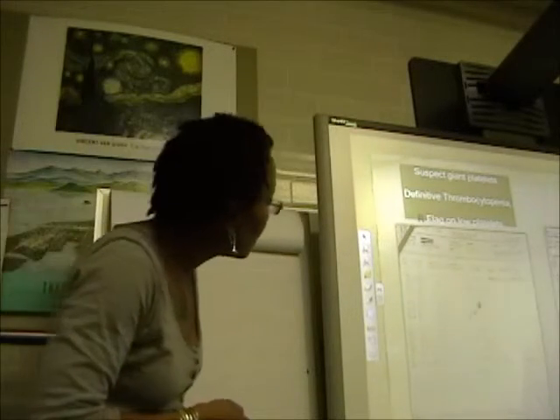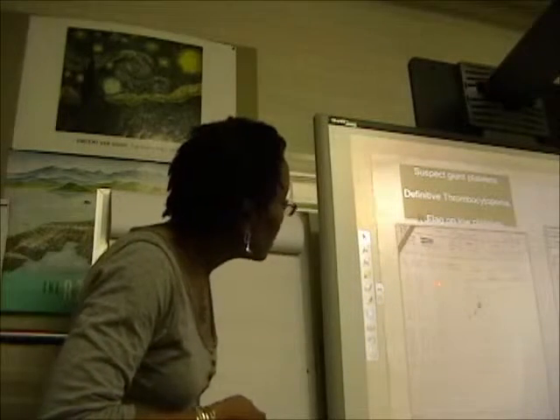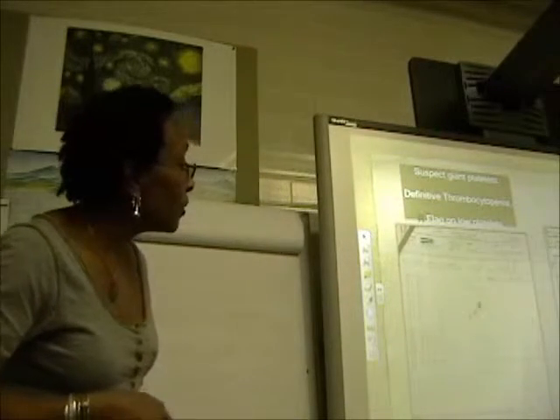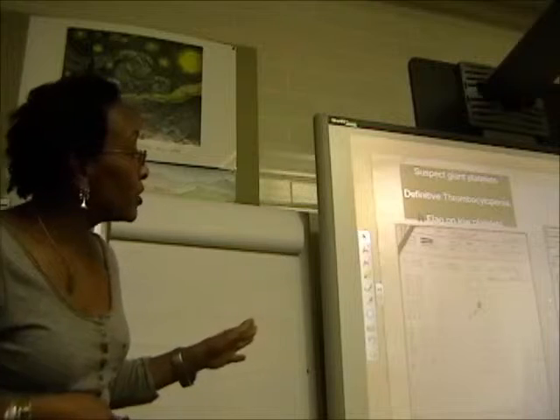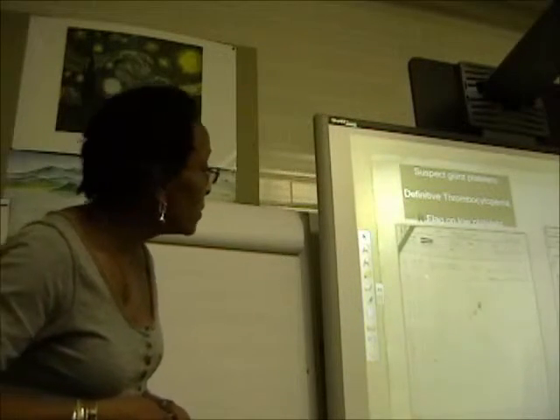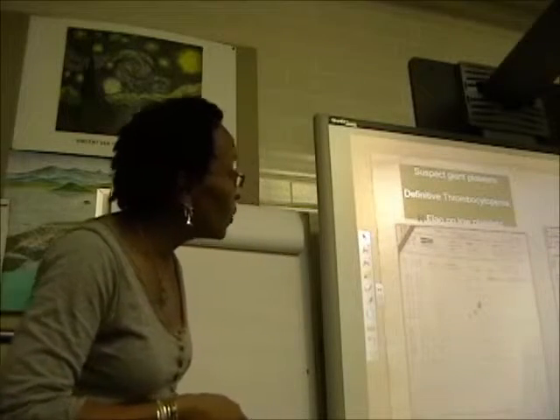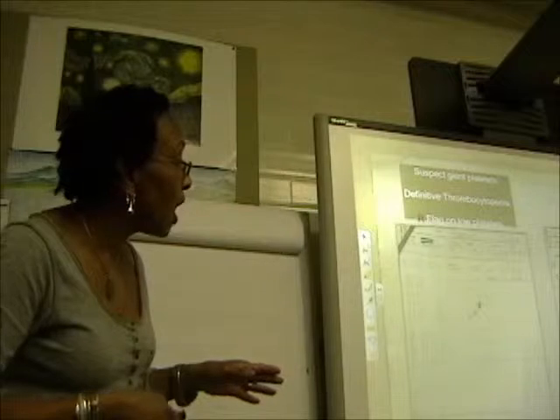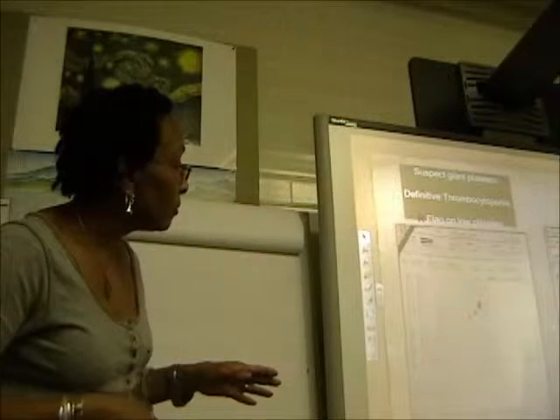Okay, this one just shows you on two different instruments how they'll read. We've got an LH750. This was run on the LH750, and it gave a WBC count of 9.8. And then on the other instrument, we've got an LH500, and it gives a little bit higher results here.